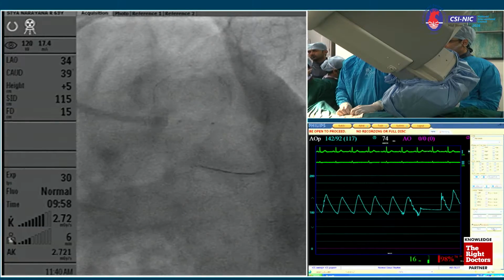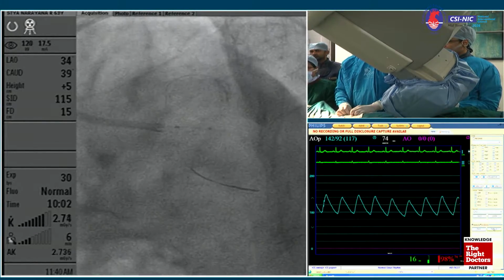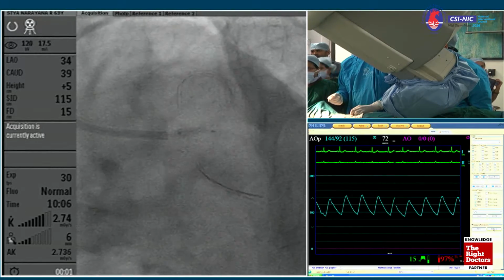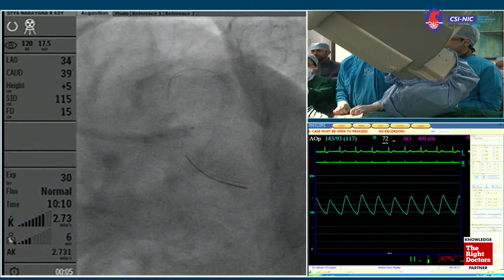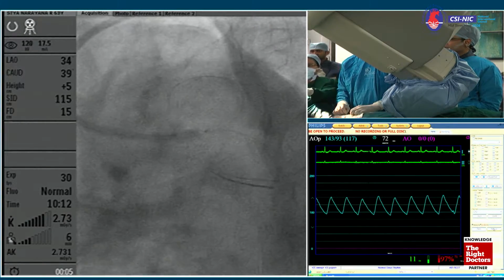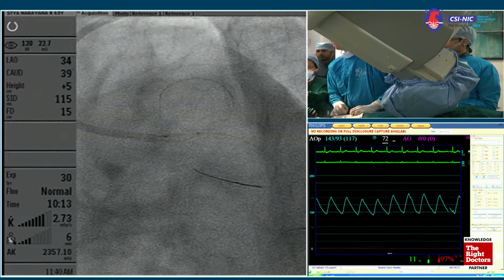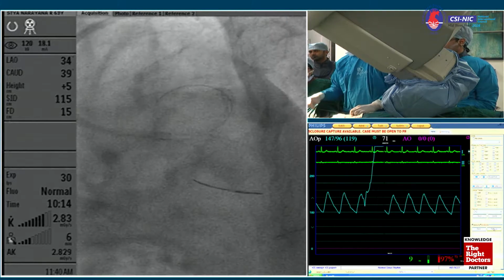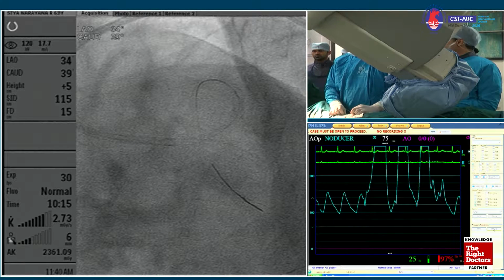Maybe tap. Christoph, this is Hui Chim here again. Hi, Hui Chim. The ostial circumflex stent appears to be probably a little bit under-deployed here. Right. Sometimes I would actually optimize the ostium circumflex first, in addition to the POT, because once you put in the stent through the stent struts into the LAD, I have seen cases where the ostial circumflex now becomes collapsed and very difficult to go through.